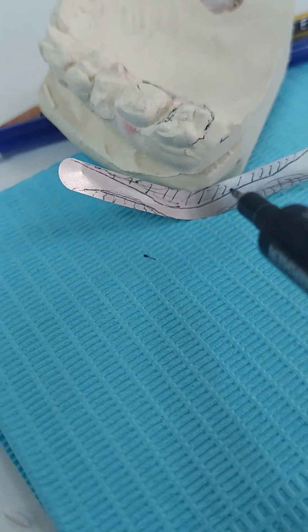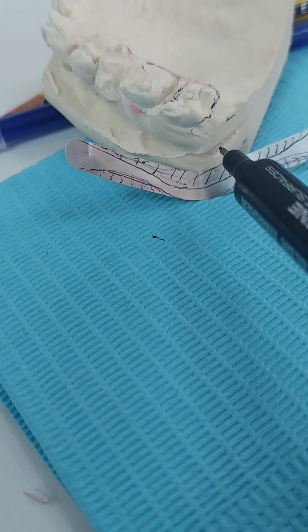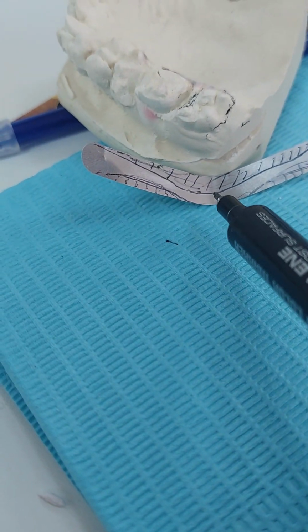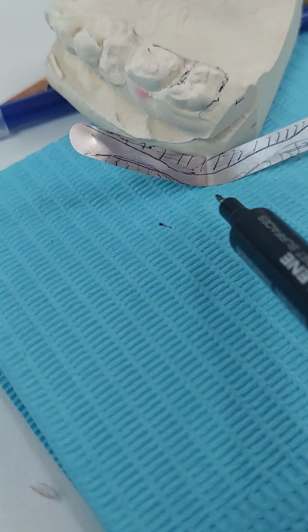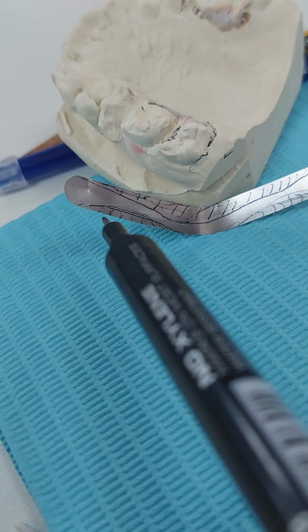Okay, so why did I remove this? Because I don't want it going upwards from the gingival margin. I want it to adapt and go outwards to create the correct gingival profile, emergence profile. Okay, so all of this is cut. This is going into the deep margin and gingiva. These are now avoiding the gingiva around the tooth.